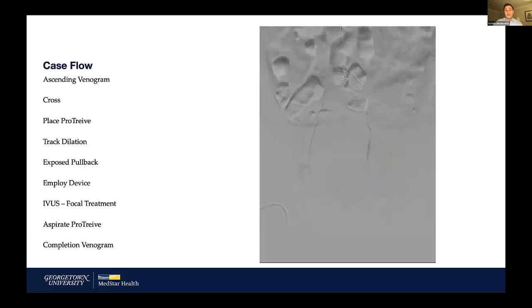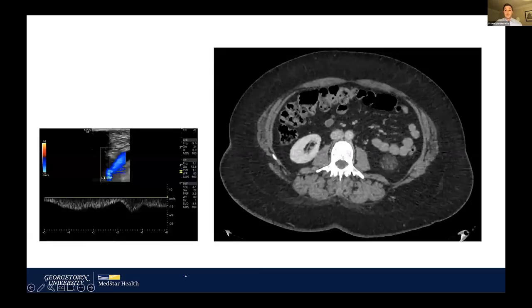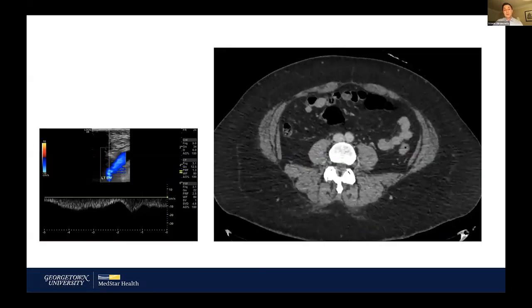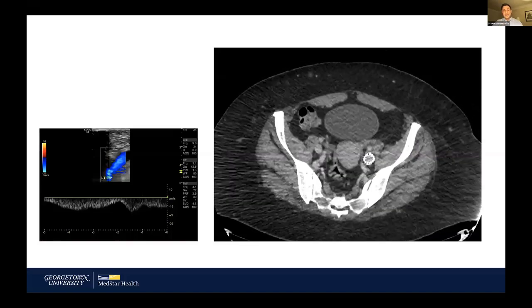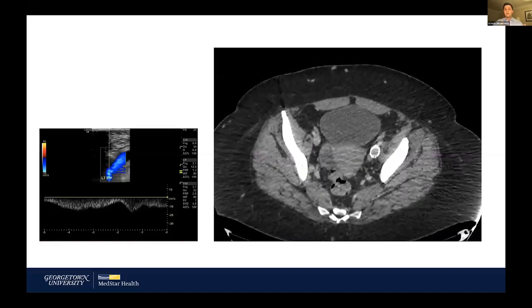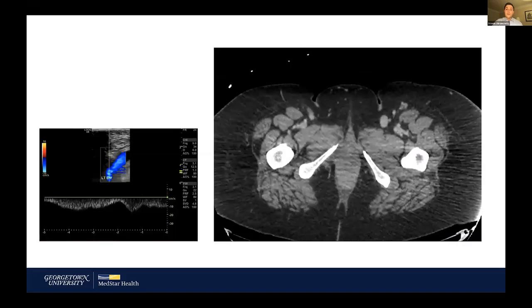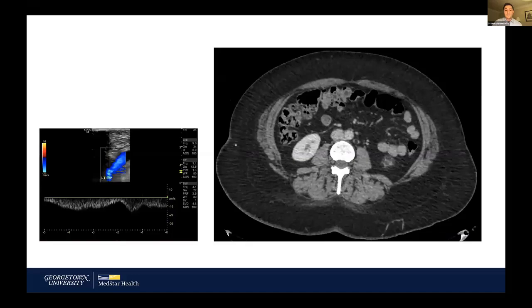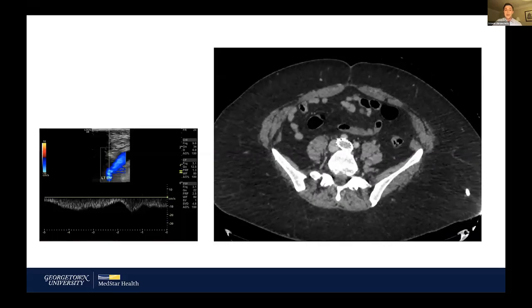One of the exciting things about this case after our completion venogram is that I've seen the patient back in follow-up. This is her one-month follow-up CT venogram. The patient reported complete resolution of her symptoms, and on the CT venogram — obtained to check for stent fracture and confirm inflow segment patency — I see a widely patent stent with some additional collaterals we may consider sclerosing. We also had an ultrasound showing great respiratory variation in a widely patent vessel as well.